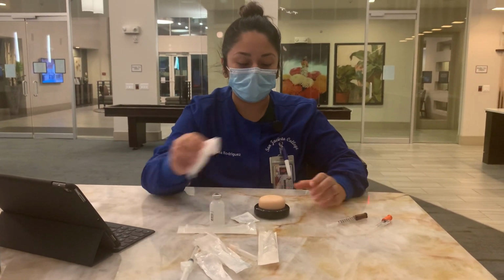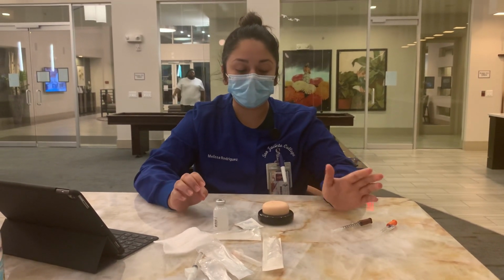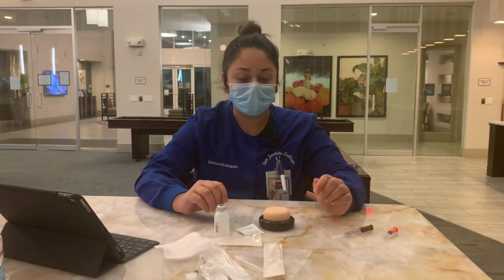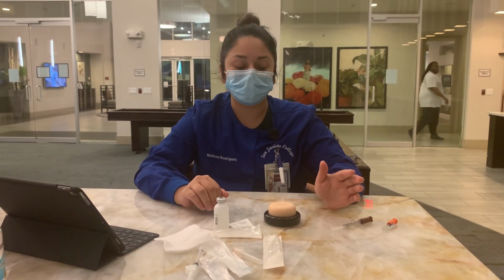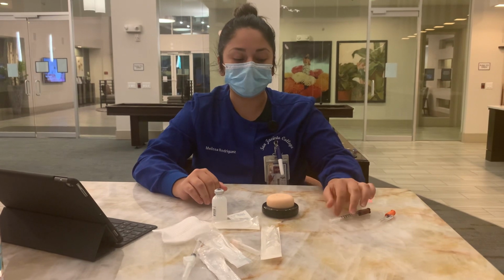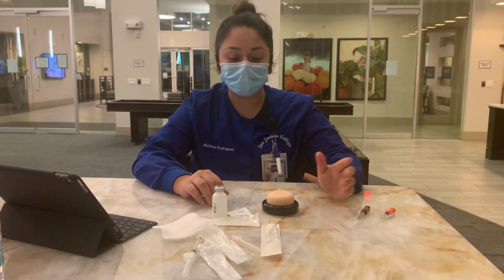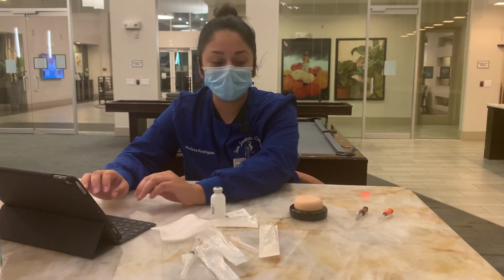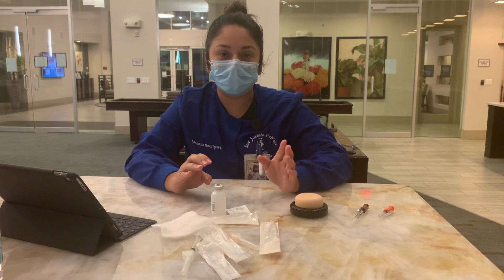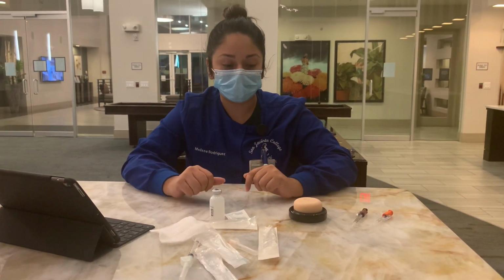I'm gonna wipe down with the gauze and tell the patient not to touch and scratch, just to leave it alone, because it can give false positive results, and it will be checked in 72 hours, 3 days, for results. Once I'm done with that, I'm gonna go ahead and document. Same thing, assess patient 30 minutes afterwards for any type of reactions.